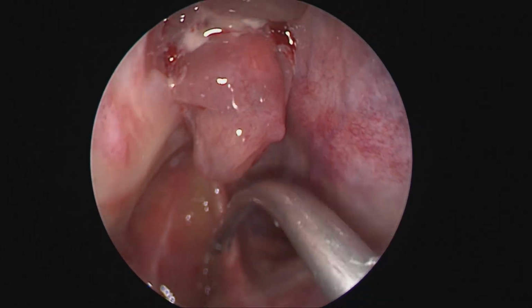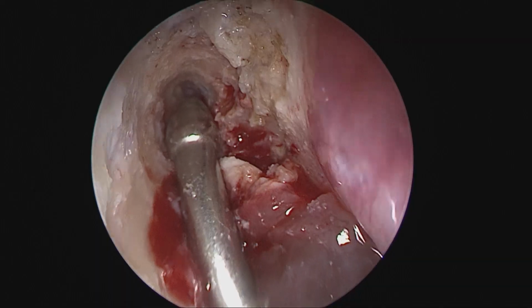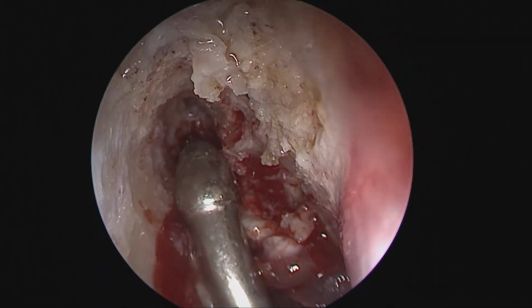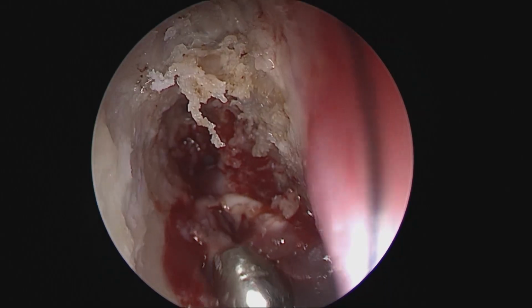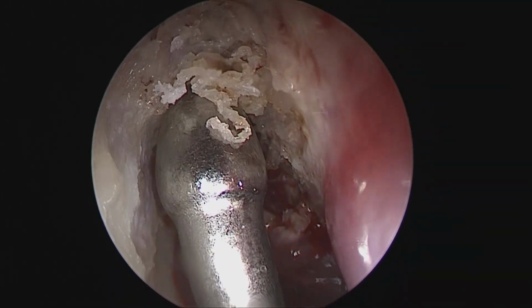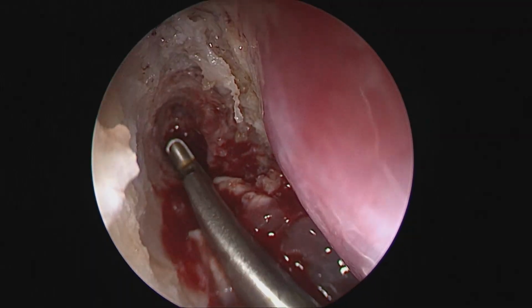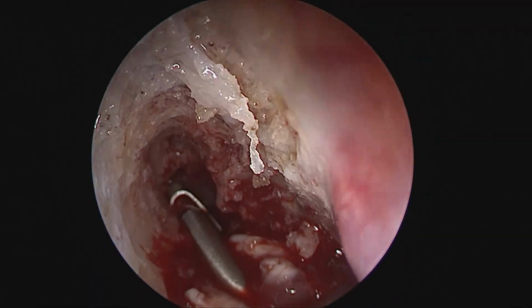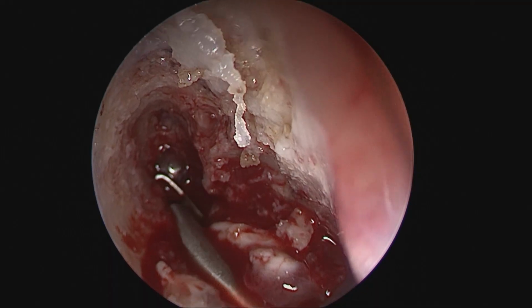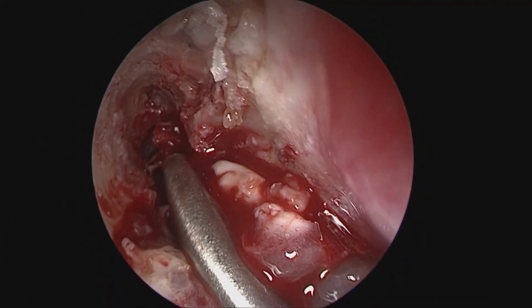You can see here the choana, the medial maxillectomy cavity, the bunch of papillomas there. And now you see how we have defined our anterior boundary, a very small limited frontal sinus, which we have just partly opened, and we would continue to open it more definitively using in between both our articulated bone punches as well as the drilling process.